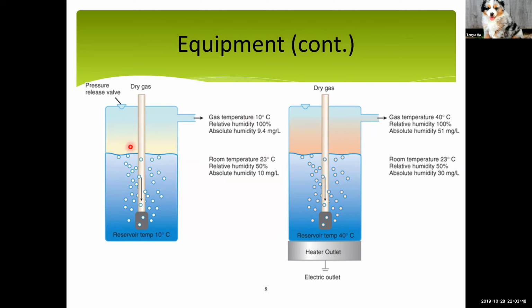But if I have a higher flow and it's coming out and going right out, that's less time of contact, and therefore less humidification that the bubble humidifier could put out. So that's an example of how time of contact could increase or decrease the humidification delivered. And that's why bubble humidifiers are not as effective at higher gas flows.